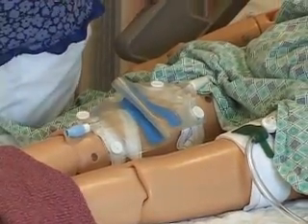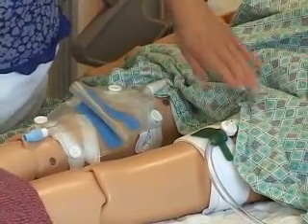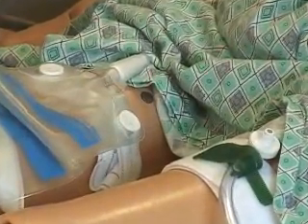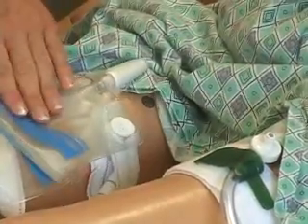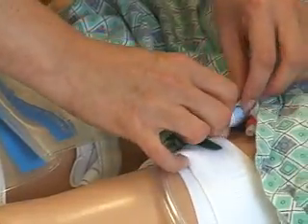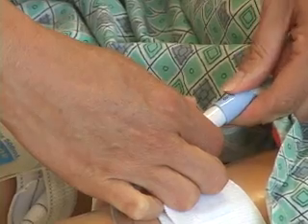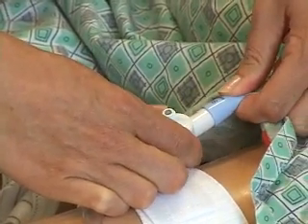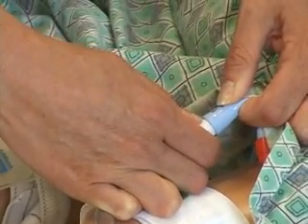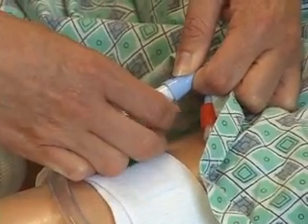You should have your alcohol prep pads ready to cleanse where the drainage bag attaches to the catheter for both disconnecting and connecting. Now that this leg bag is in place, what you should do is get ready with your index finger and thumb on the catheter and your opposite hand on the drainage bag. Gently disconnect the catheter from the drainage bag.